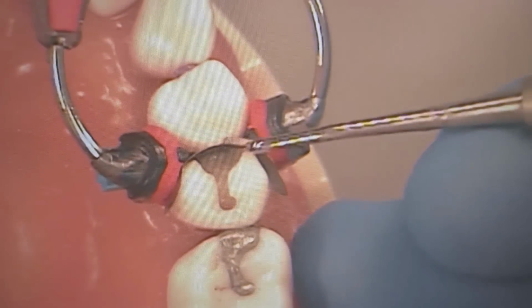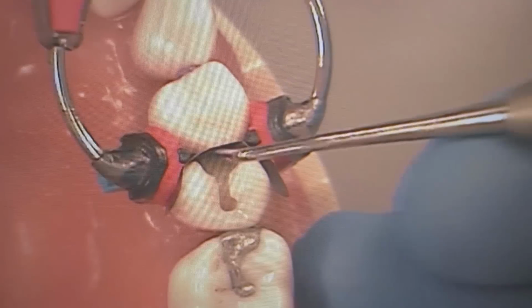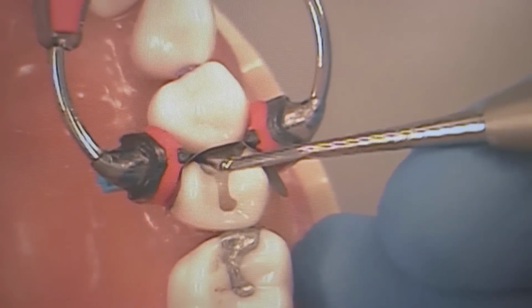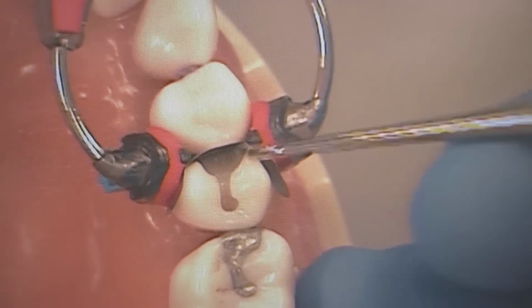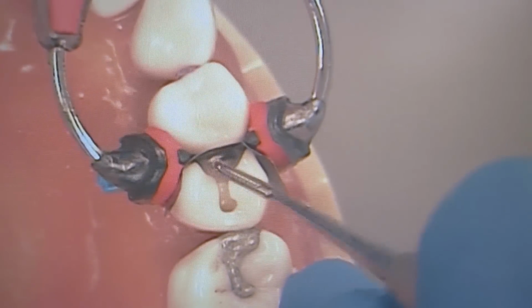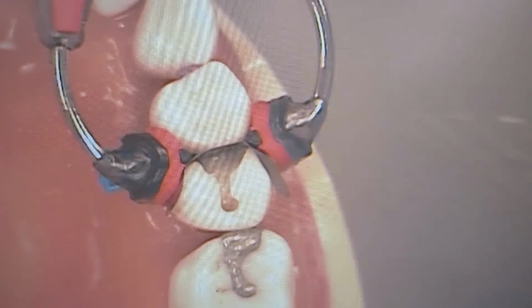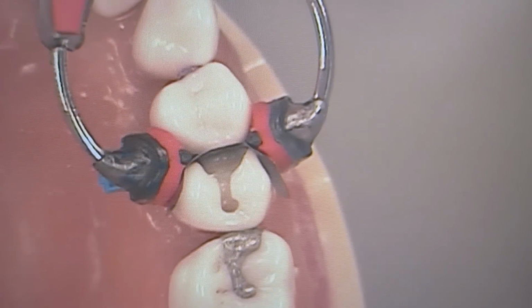Right now, before I light cure, I'm trying to smooth out the first layer so I can place the second layer on. Composite likes to bond to rounded areas instead of sharp areas. Do you see it nice and rounded? So smooth it out before you cure it. The layer is right below the pulpal floor.